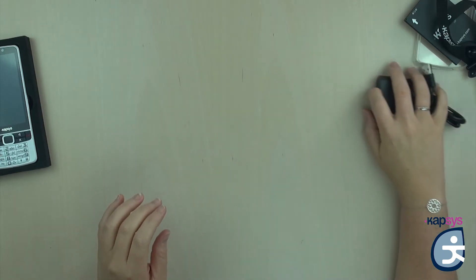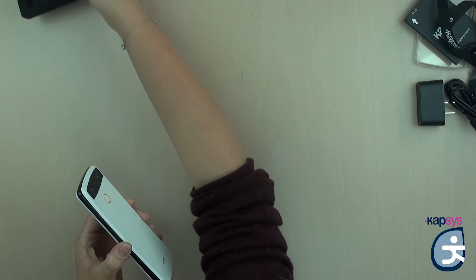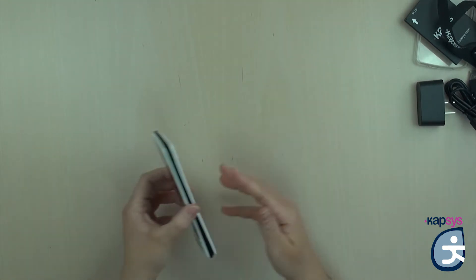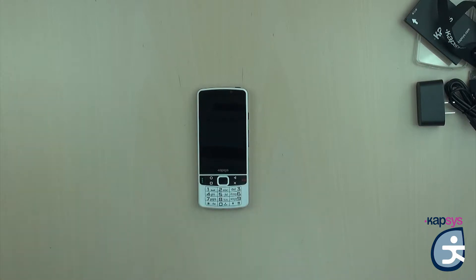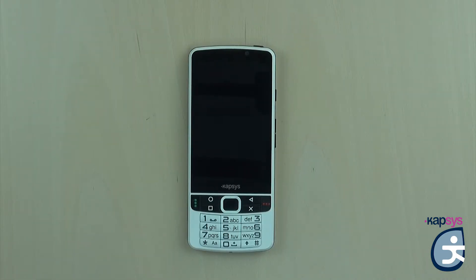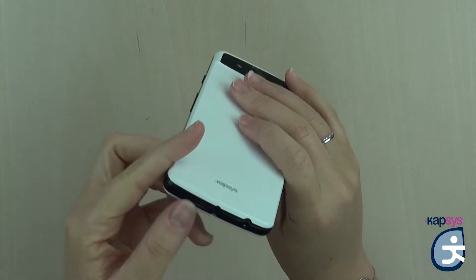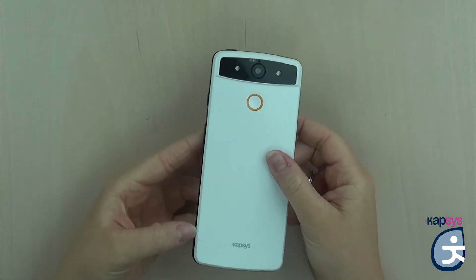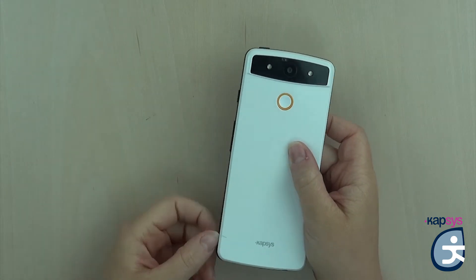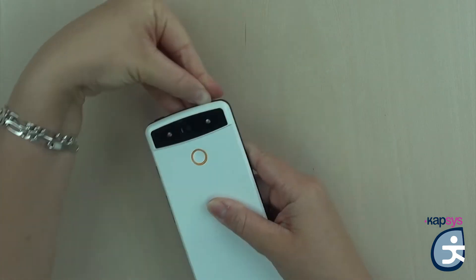Now let's focus on the phone. To open the phone and put the battery, the SIM card, and possibly the SD card, we will remove the back cover. To remove the back cover, just turn the phone around and find a small notch located at the bottom left corner. Put your nail between the black belt and the back cover and slide it up all around to unclip the different pins.